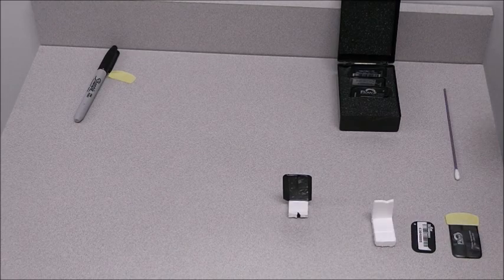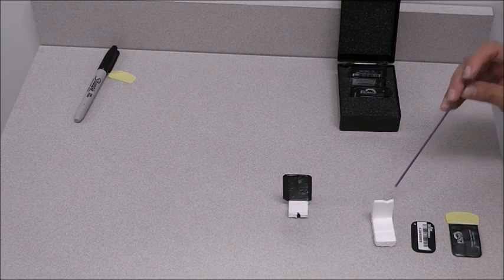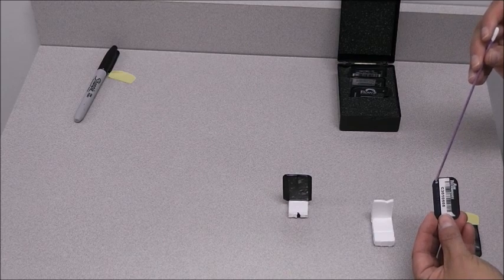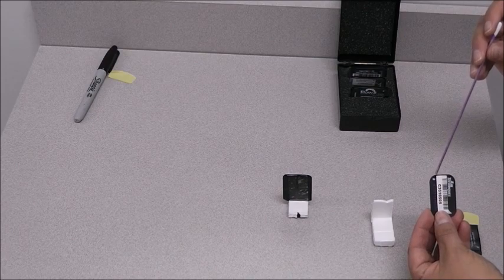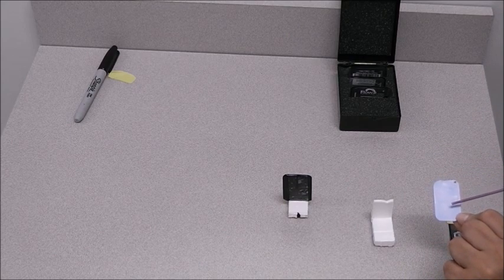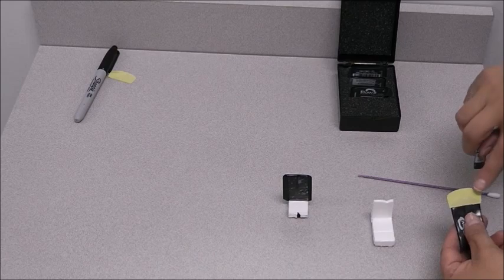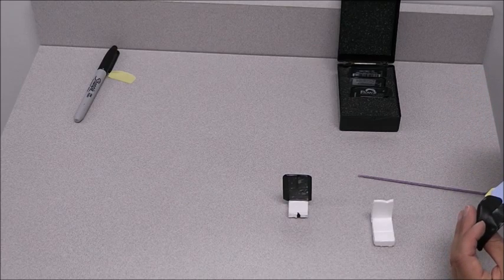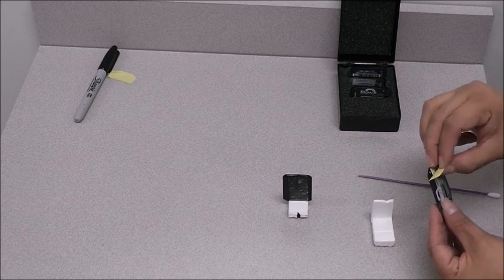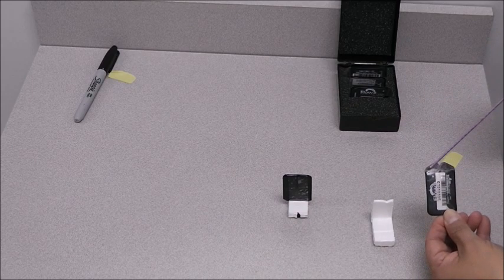We're imaging maxillary and mandibular anteriors using a number one plate. We're going to place the plate in a barrier. On your number one plate you have an 'A' which is your orientation for placing the plate — once it's in the mouth the 'A' is always on the incisal edge. The number one plate has a sensitive side, the blue side, so we're going to protect it with a barrier. Place the 'A' where the adhesive is, with the blue side towards the black side, slide it all the way down, and seal it.